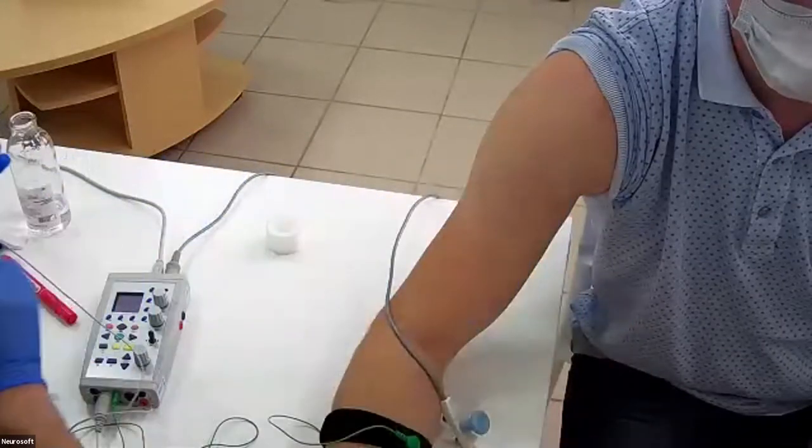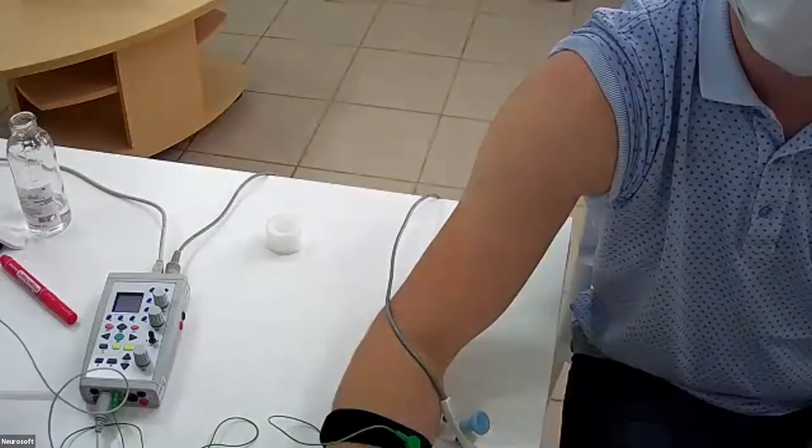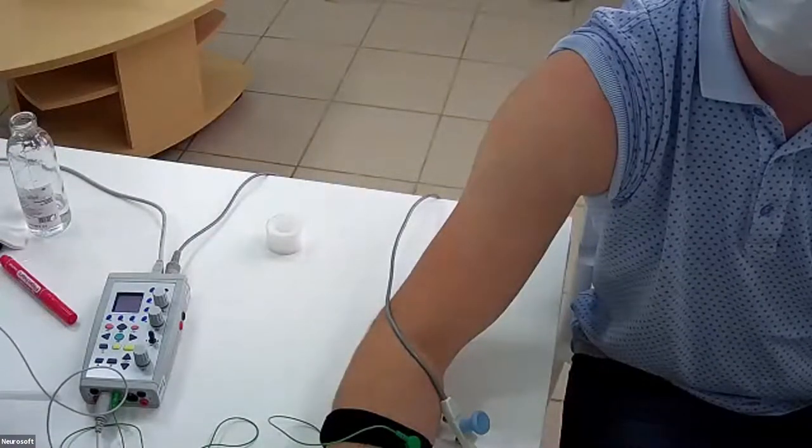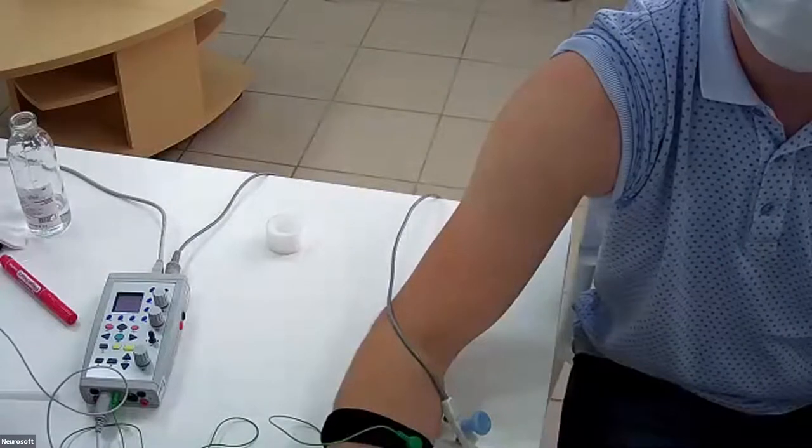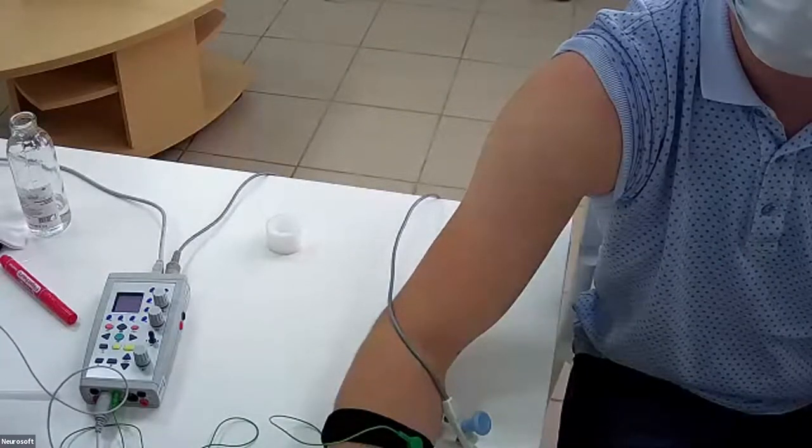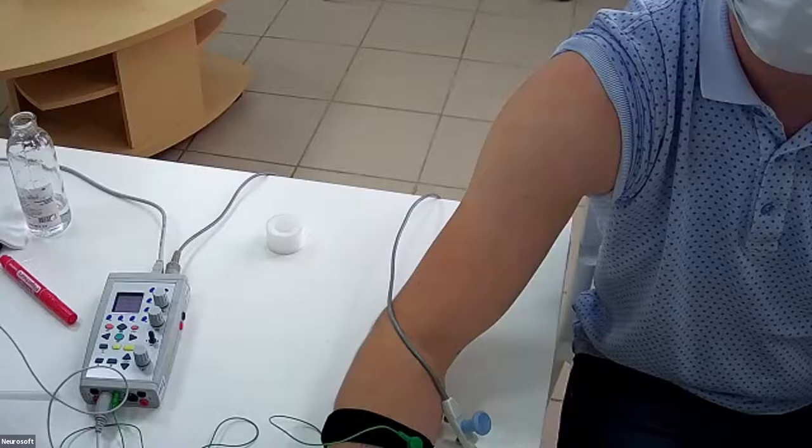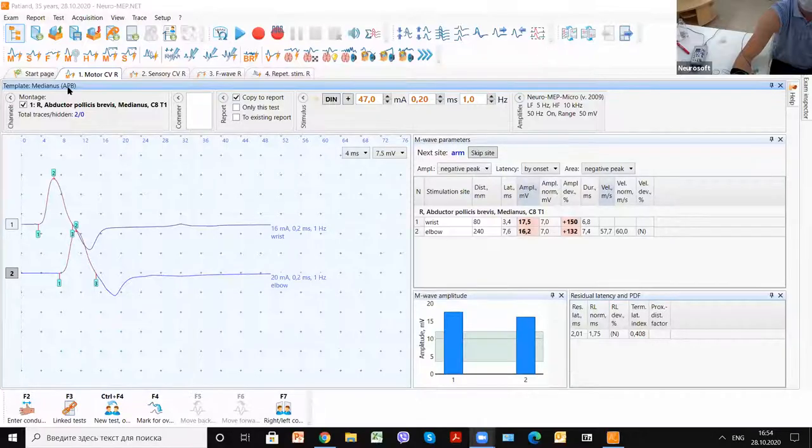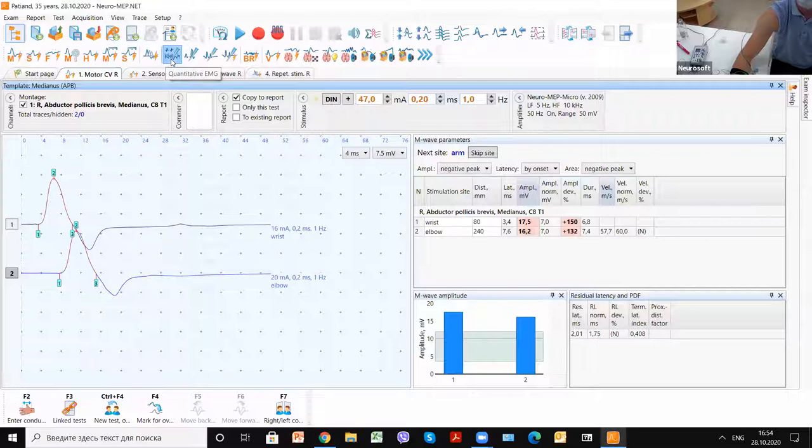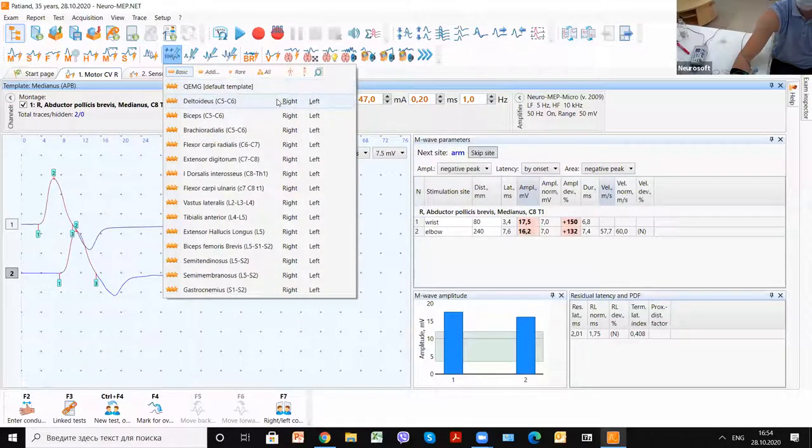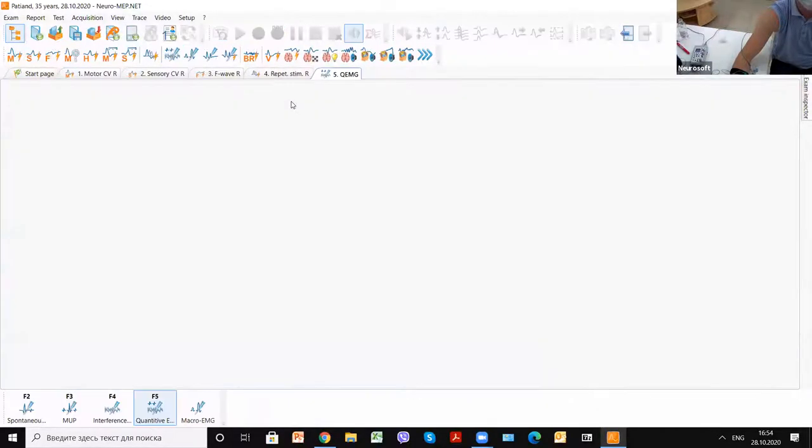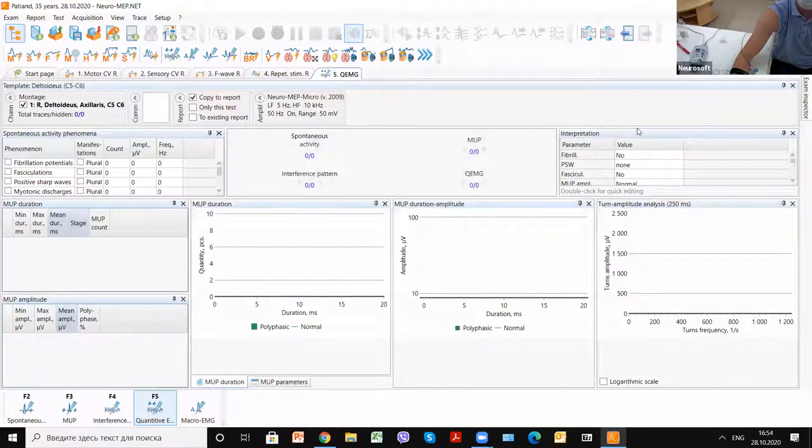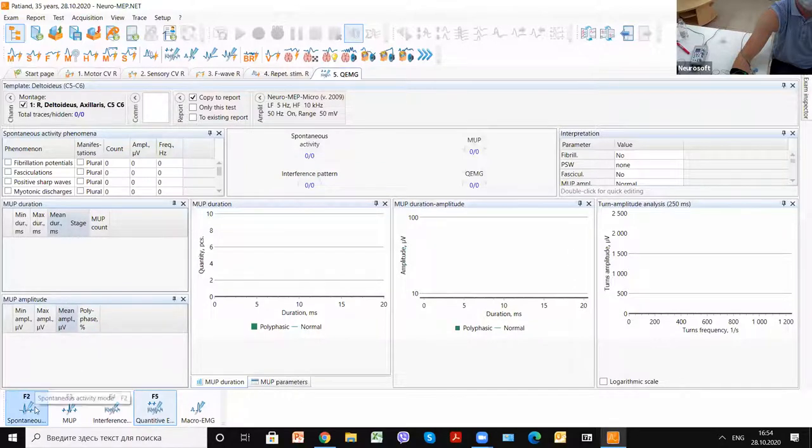I will share the screen. We will choose needle EMG. Deltoid muscle, we can choose the right side. First of all, we see the main window with all tables of parameters.